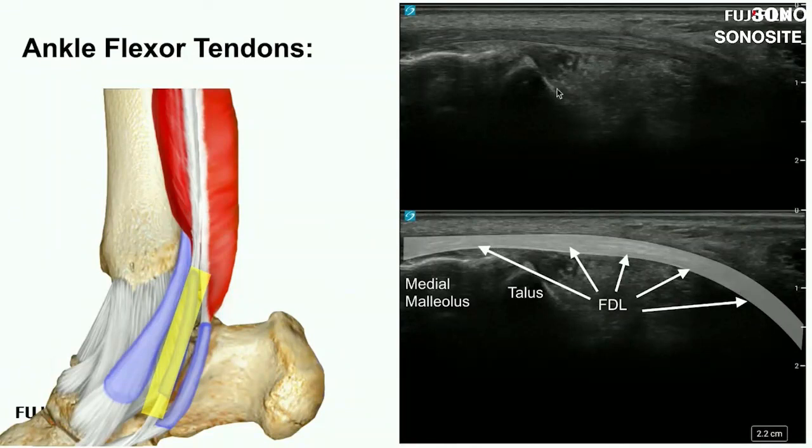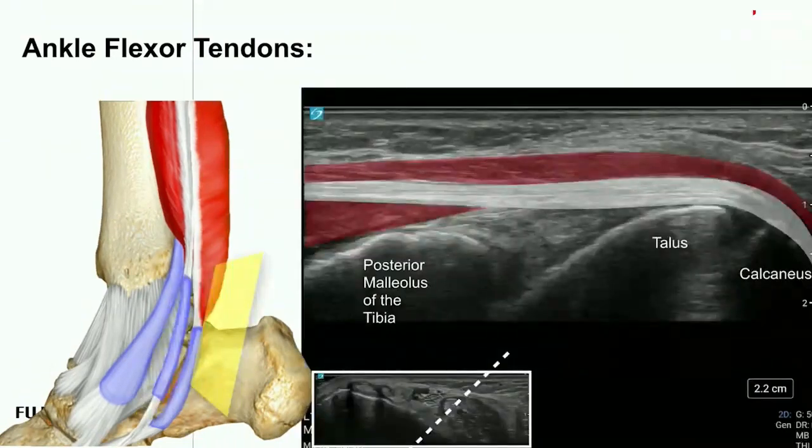What looks like a bunch of weird synovitis and junk out here is really just those transverse views of the deltoid ligament complex. And we don't want to call any of this fluid or any ratty tissue disruption until we dynamically take a look at the deltoids. Even more posterior in the same parallel fashion. You can see now we're wrapping our transducer more posterior in the ankle in this axial slice, and you can see how far back we're going.